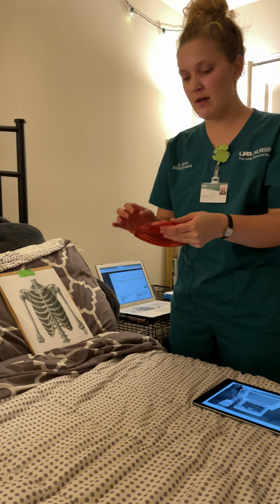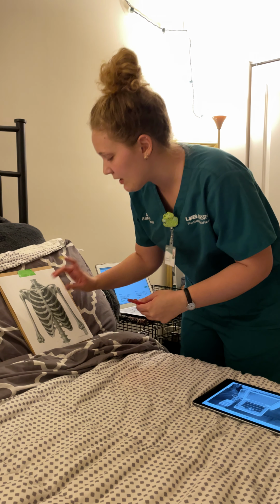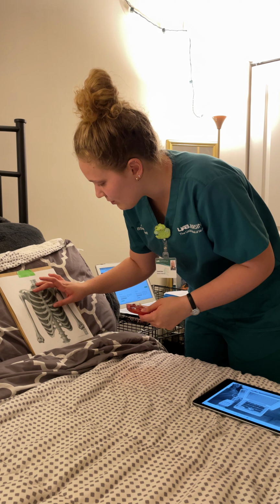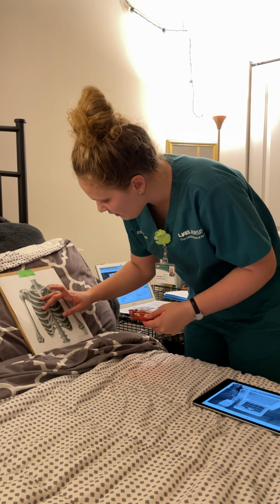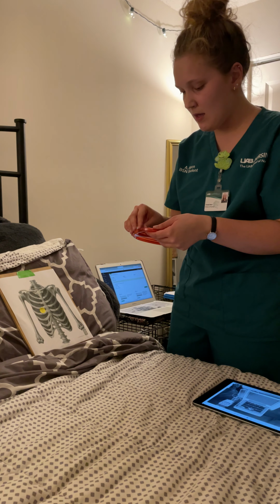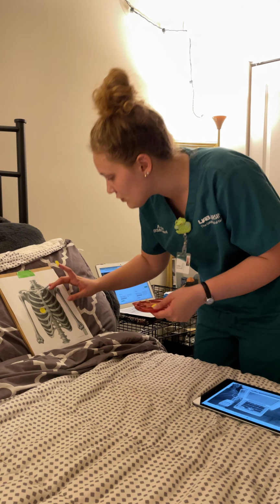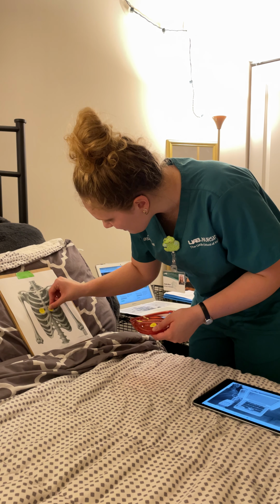So starting with V1. V1 will go on the fourth intercostal space of the right sternal border. So 1, 2, 3, 1, 2, 3, 4, right there. And then V2 will go on the fourth intercostal space left sternal border. So 1, 2, 3, 4, right there.